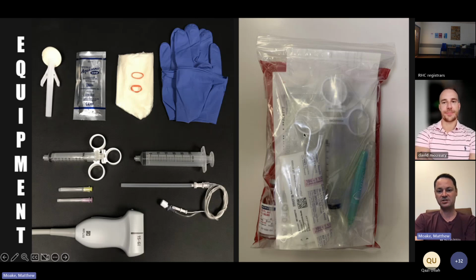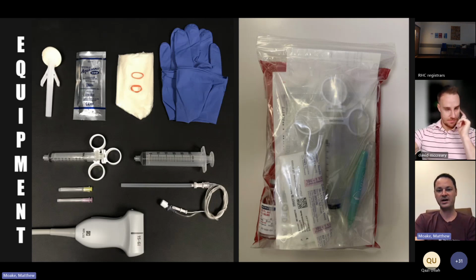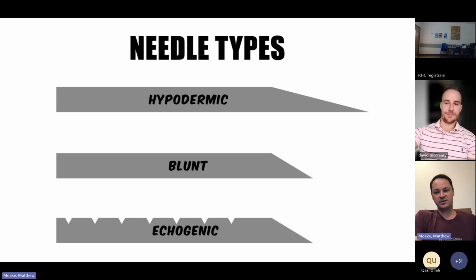And like I said, I usually package these all into little kits. Currently I have them in these so my providers can grab them. They've got everything in them but sterile gloves, so they can go right in to minimize the running around to find gear.